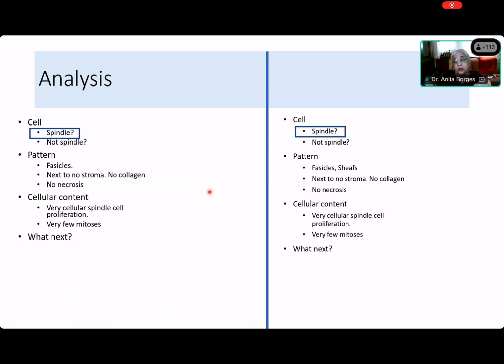Okay, so what next? We have to think of possibilities, right? So what are the possibilities? There's only one possibility. This cannot be benign. There are no mitoses, yes, but do you know any benign spindle cell tumor that is so cellular? Yes, you get some cellular leiomyomas, but they have extremely pink cytoplasm. The cytoplasm is not pink. So there's only one thing, and this is a spindle cell sarcoma. But what is this one? What are these funny spindle cell sarcomas that do not have mitoses consonant with their cellularity, and don't have necrosis? If you know about this, then you know what these tumors are likely to be.